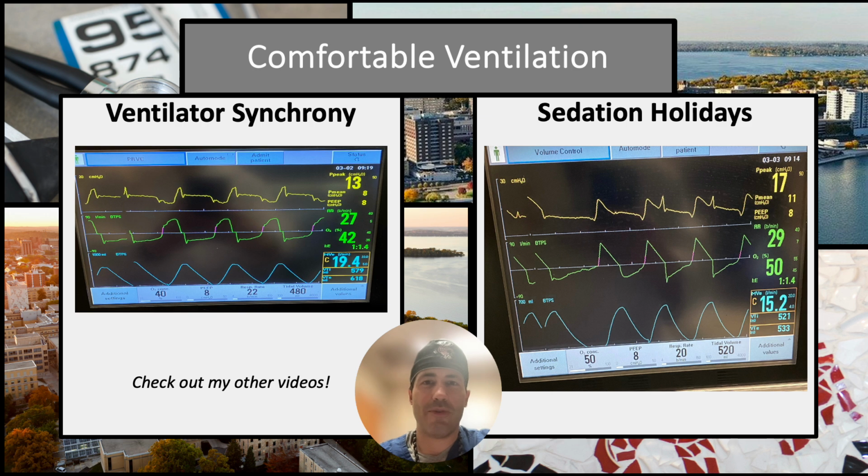Now, comfortable ventilation is key to our ventilator settings, and you should definitely check out all the other videos I have on ventilator synchrony. If you've seen those, give yourself a quiz by looking at these here. But when we don't pick the right ventilator settings, patients are unable to get sedation holidays. They get more drugs, more medicines, they're agitated, and all those things will drive terrible long-term ICU outcomes like PTSD or even cognitive loss. These are big deals, and they happen frequently, and we can prevent them from happening in some patients by picking good mechanical ventilation settings.